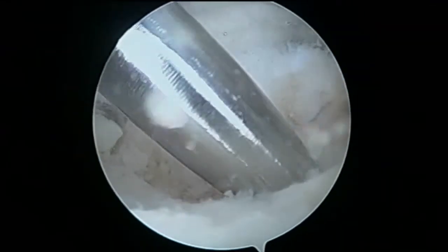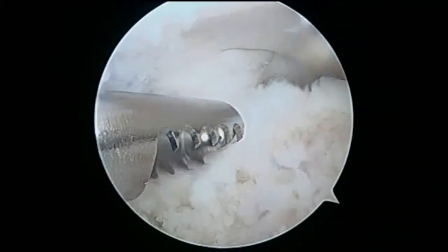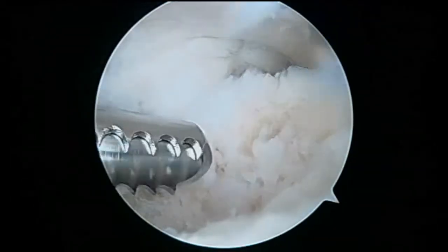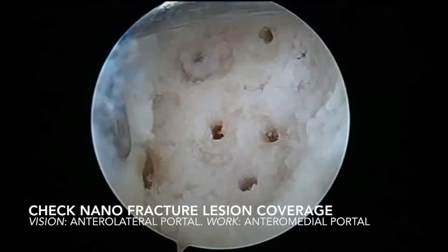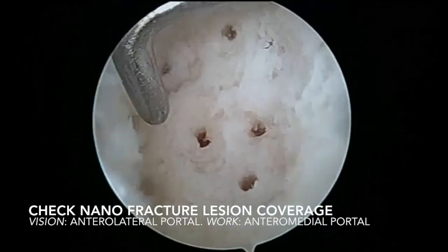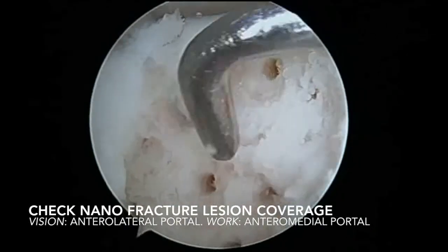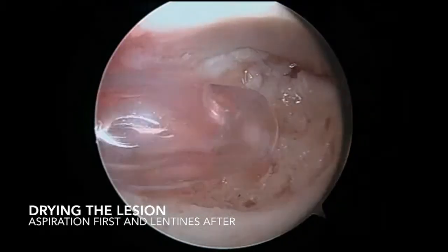In this case, we perform 8 nanofracture holes. After that, we debride any possible small bone or chondral free fragments. Then, we proceed to change vision to the anterolateral portal to take an overall view of the lesion preparation, confirming the right number and positioning of the nanofracture holes to cover all of the lesion area.